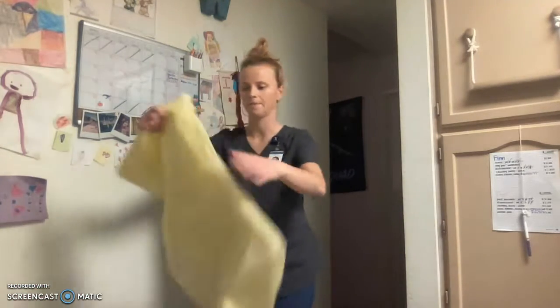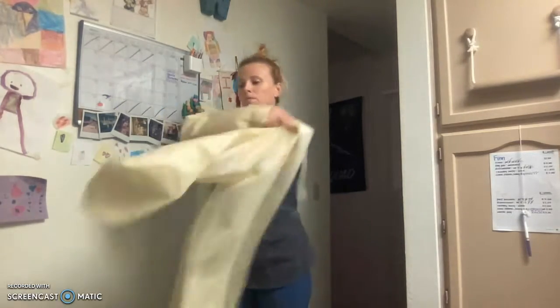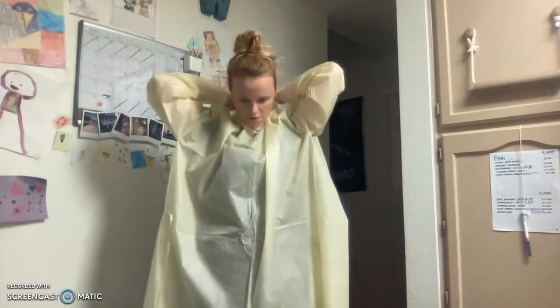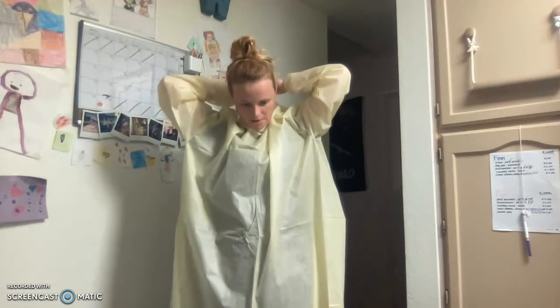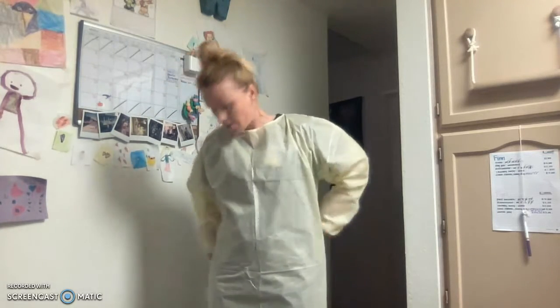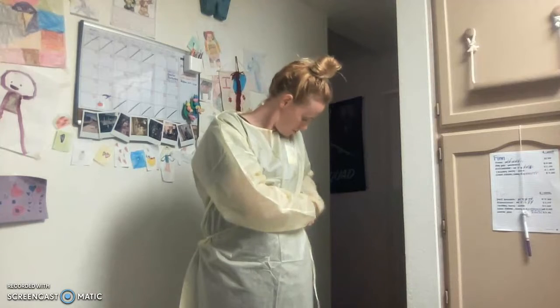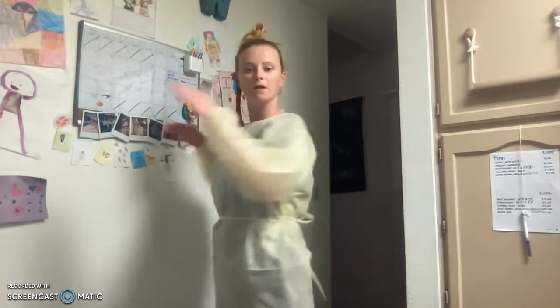First, we'll tie the gown. Tie around the neck first. Make sure it's down, covering my clothes. For the waist straps, I need to make sure I tie them as far back as possible. Clothes are covered.